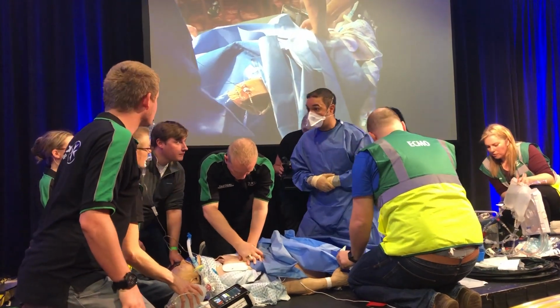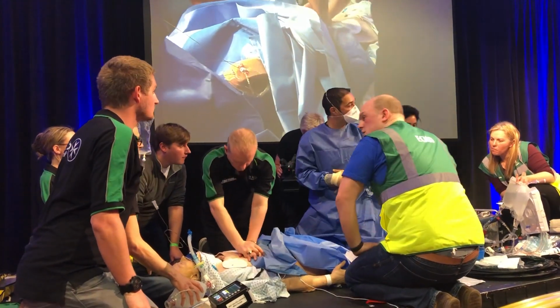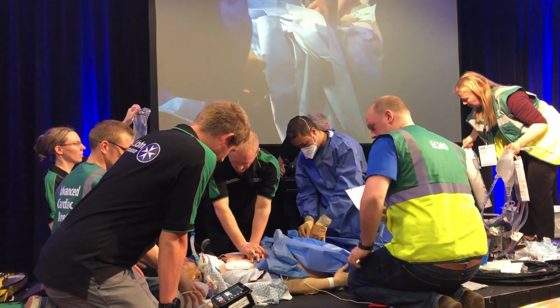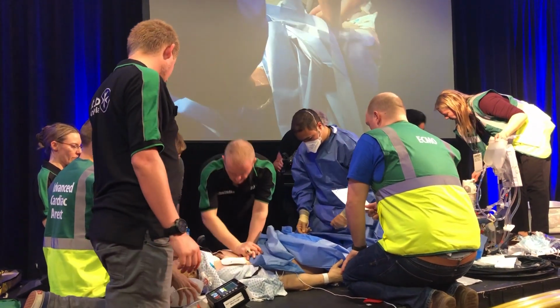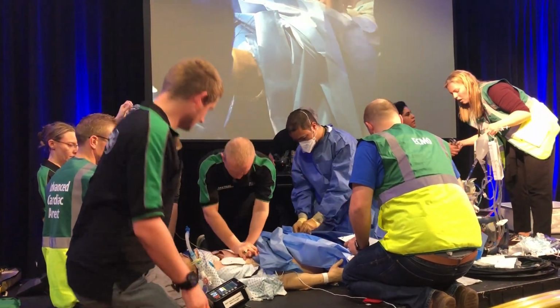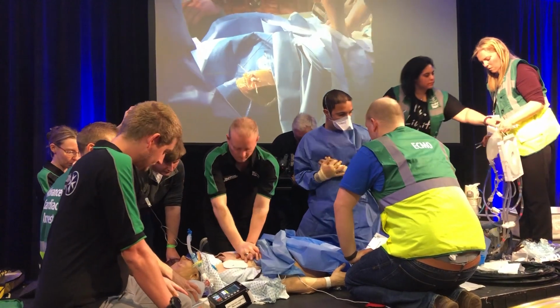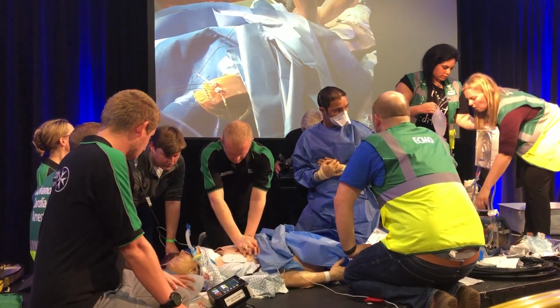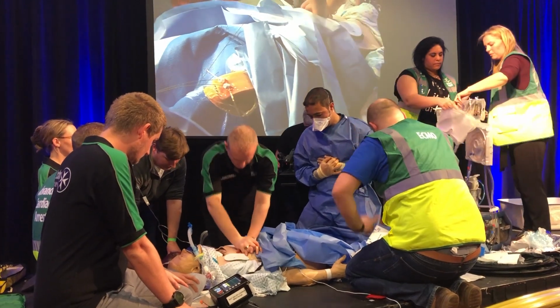So, have you got both wires in? At this point, the ECMO team are not committed to ECMO. They can just take that out. But the next stage, big dilators, is a commitment. Now, if they've done this before 20 minutes of collapse, then they'll just wait. We're not going to go on before 20 minutes because ethically we want to give them gold standard treatment, which is 20 minutes of resuscitation.